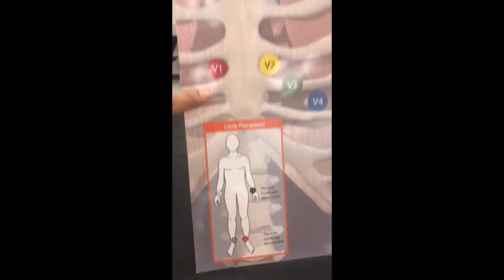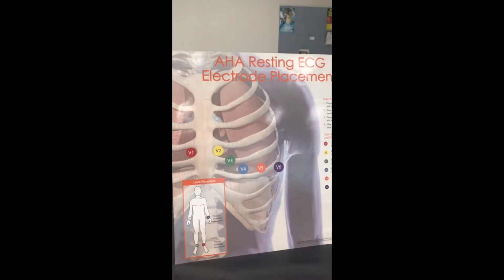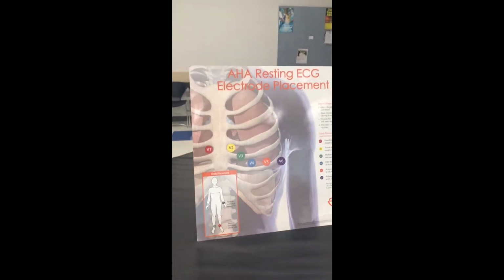Then V1 to V6. The skin may need to be cleaned prior if oil or debris is present. Use alcohol for cleansing. If the patient has too much hair, the patient may need to be shaved.